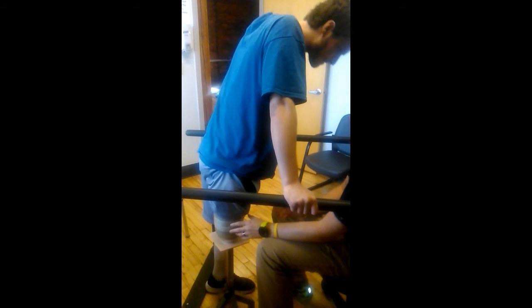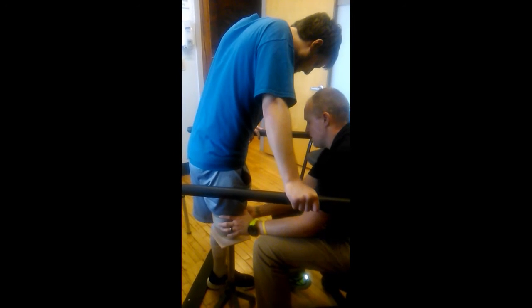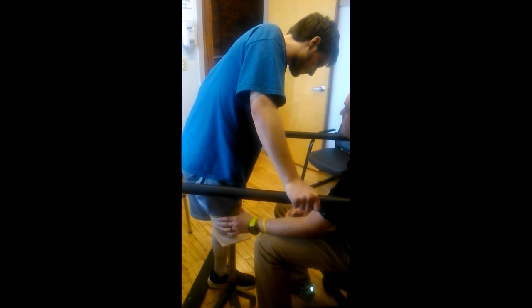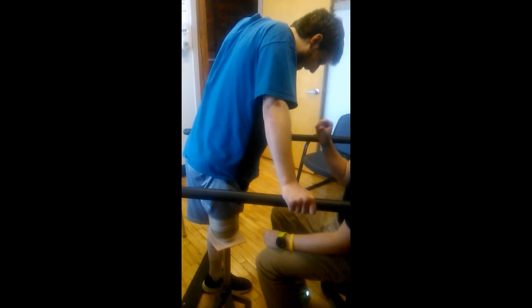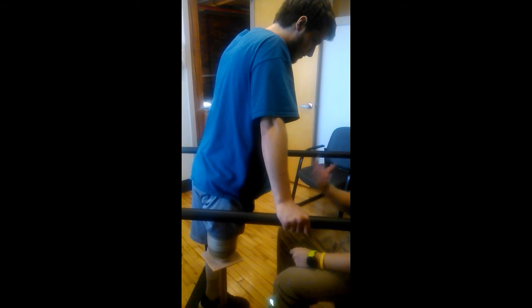How do you check that you're all the way in? You're going to unscrew the valve, because the finished one is a screw valve. You're just going to stick your finger right there. That's what you want to feel — that means you're all the way in. If there's any space in there, you're not in all the way. What could happen is you could get just like a vacuum pull on the end of your limb, and it can cause irritation or redness.